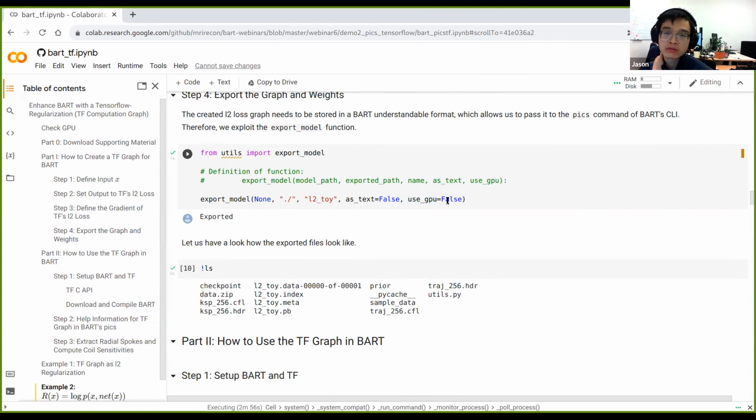But if the libraries have GPU support, it will take the GPU, just ignore all the settings. I think the BART part runs on the CPU. Yes. So TensorFlow will copy automatically to the GPU, execute the TensorFlow part there, and then copy back.